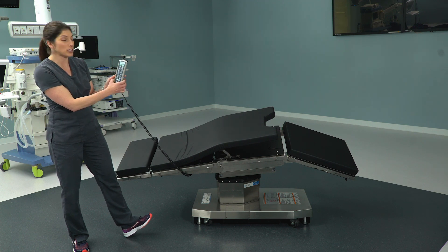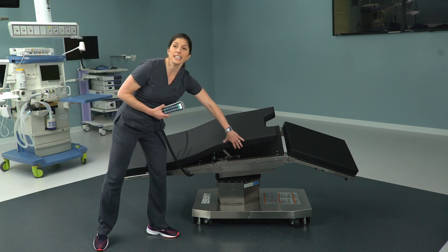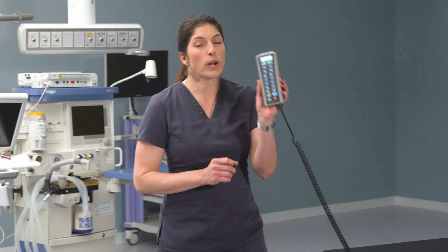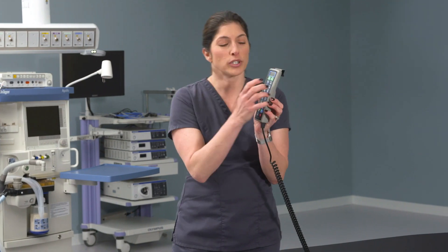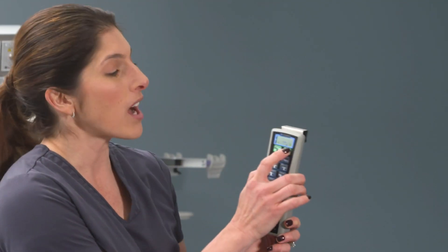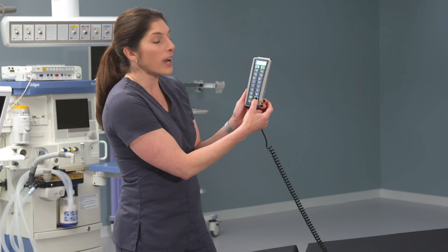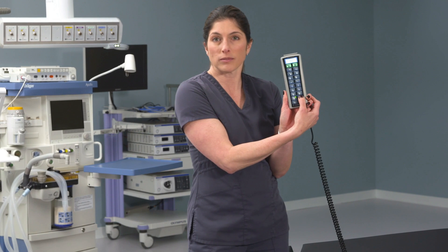Now we can raise the kidney bridge. Another nice feature is that the kidney bridge is now radiolucent. One of the other indicators on the LCD screen is floor lock and unlock — you'll see there's a green lock button indicating that we are locked down to the floor. If we press and hold floor lock, the screen will tell us to hold three seconds to unlock.